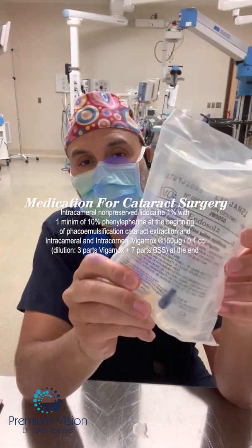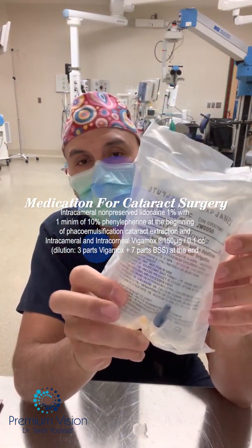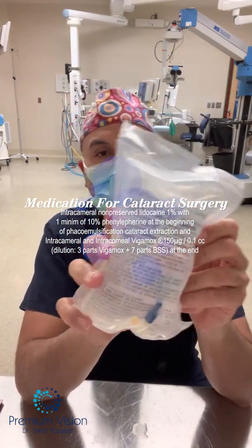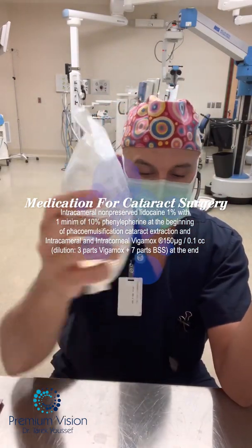This is the solution we use for the FACO — the endosol. I don't add anything to it; I use it as it is.